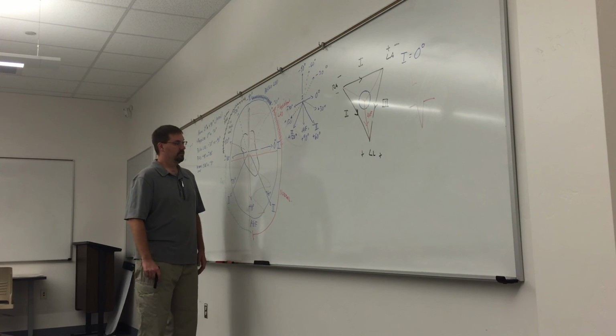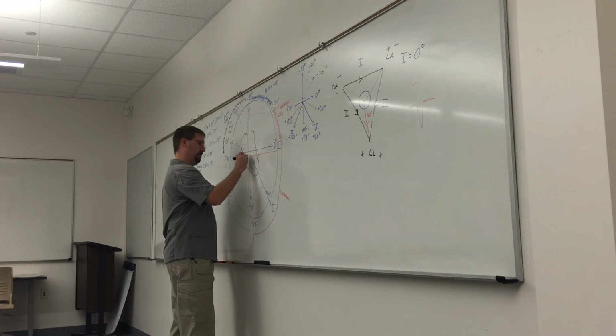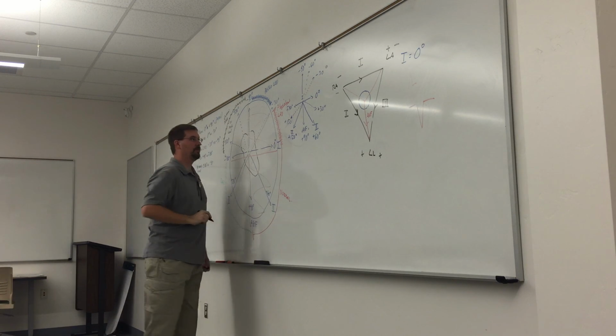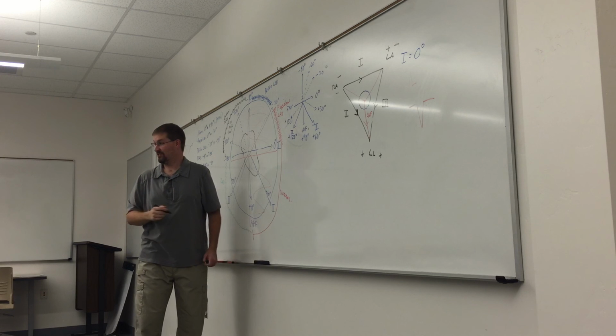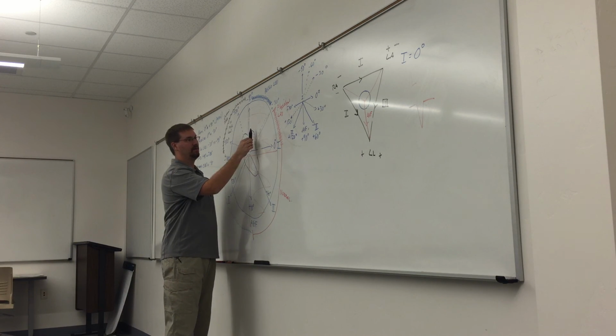What is perpendicular to lead 2? Negative 30. Okay, so this line right here. And is lead 2 up or down? Or negative deflection, sorry. Negative deflection, so am I going to go this way?